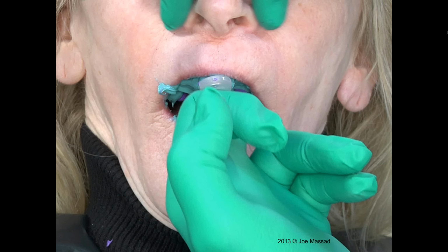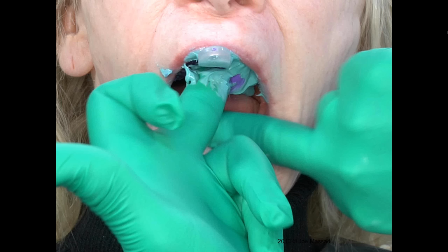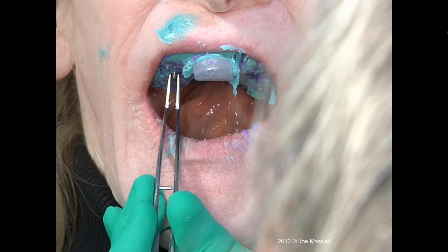Now we're removing these. And now we're going to deliver the tray impression. Now, you see a very nice impression, very little voids in here, and I've captured everything I want. We're going to make a soft tissue model now.